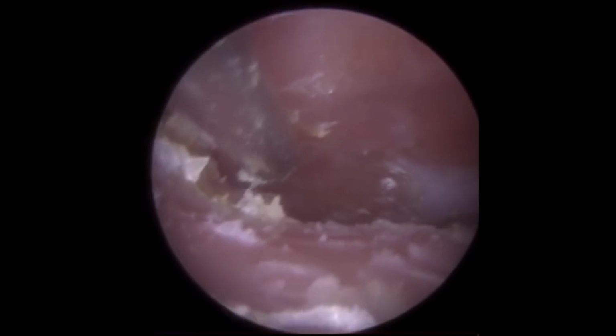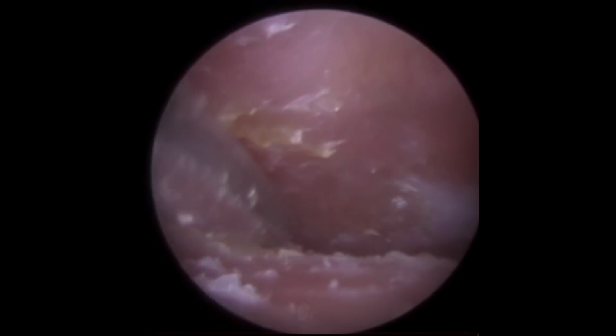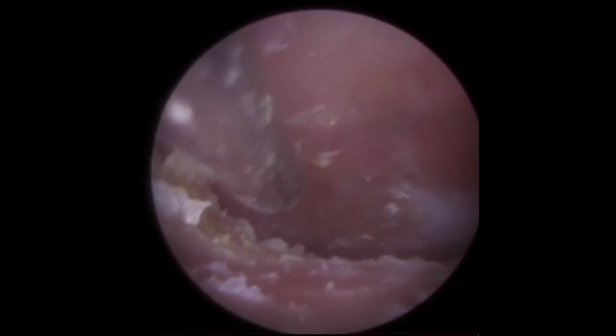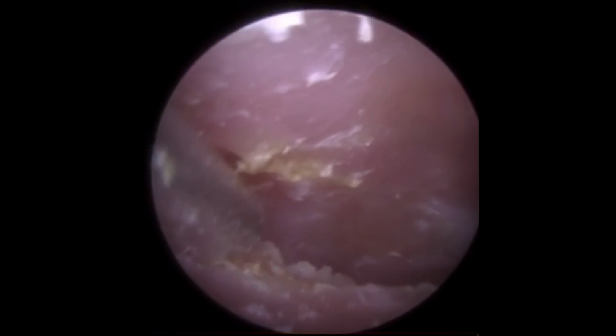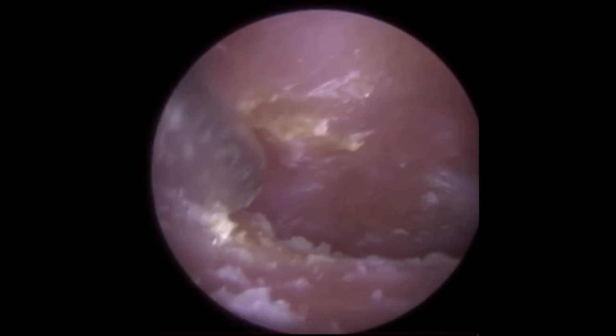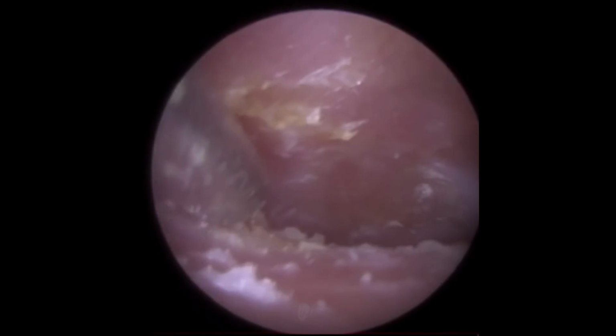The less sound that the tympanometer detects reflected back from the eardrum obviously means more sound is able to travel through and conduct through the eardrum and through the bones. And that's what we want. The less sound reflects back, the more likely your eardrum is functioning fine. And we can check that at different pressure levels as well. So it does a pressure sweep.